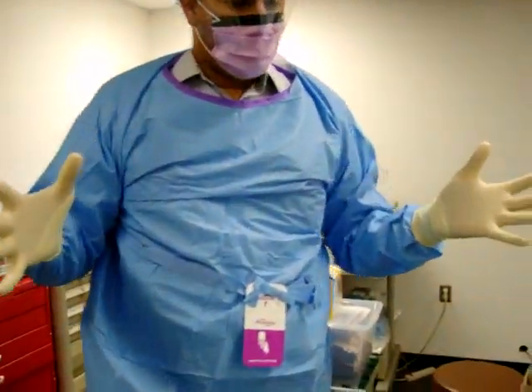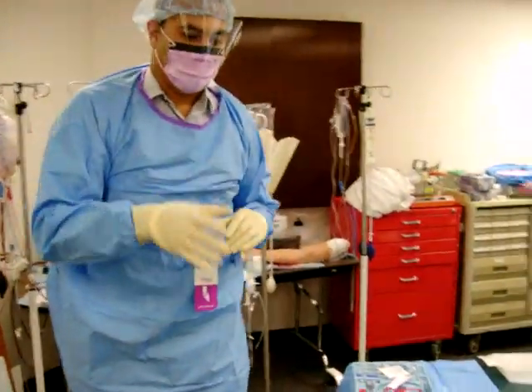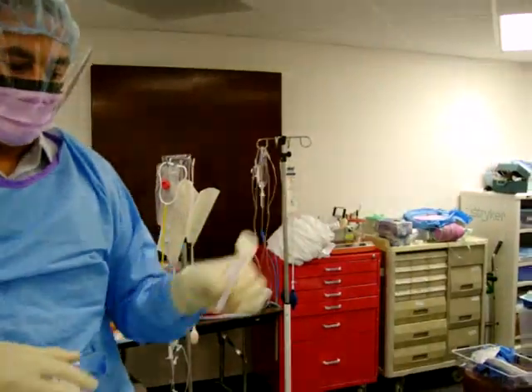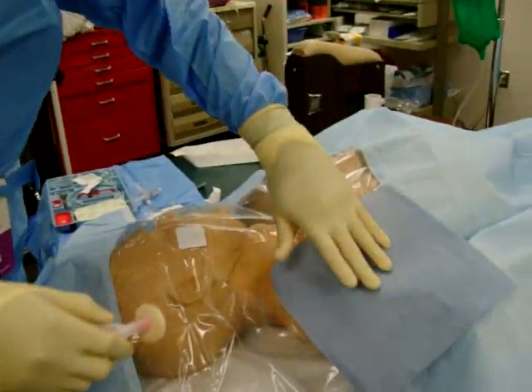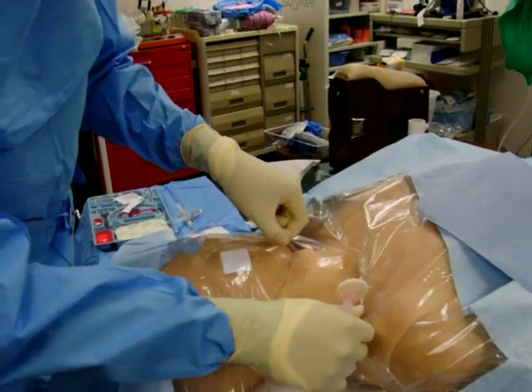Once you get that, pull it over and you can see it's covering — it may not be the neatest. The cotton around the gown is about at your wrist. If you have it further up your hand, it makes it difficult because when you stretch your arms the sleeve wants to pull back. So you're sterile and ready to go. Your probe is ready, patient's gowned, kit is getting ready, and you're getting ready to do your procedure. I have the sterile chloroprep here, which I won't do on the model because it will stain, but you can reposition where you would want this.